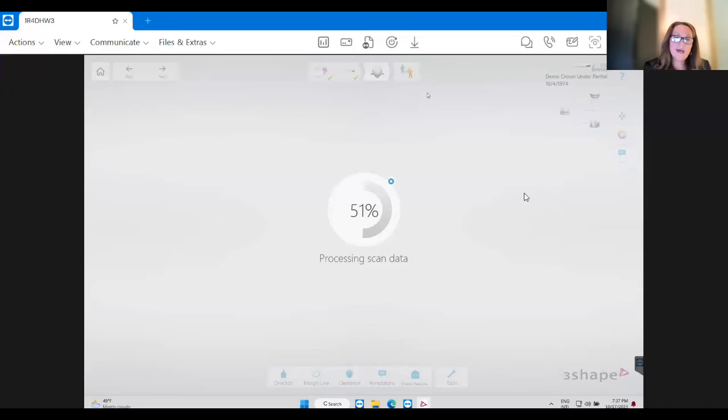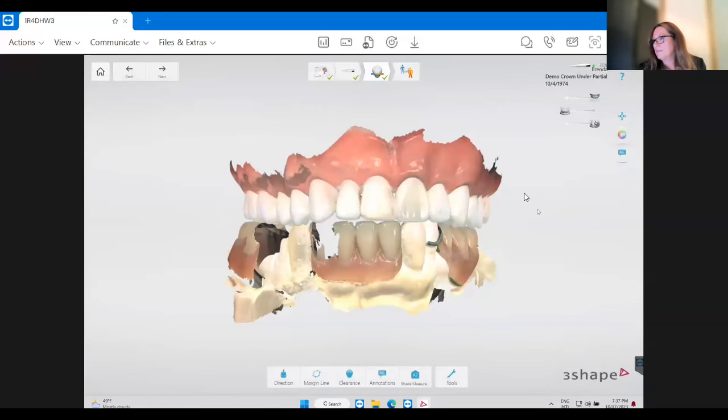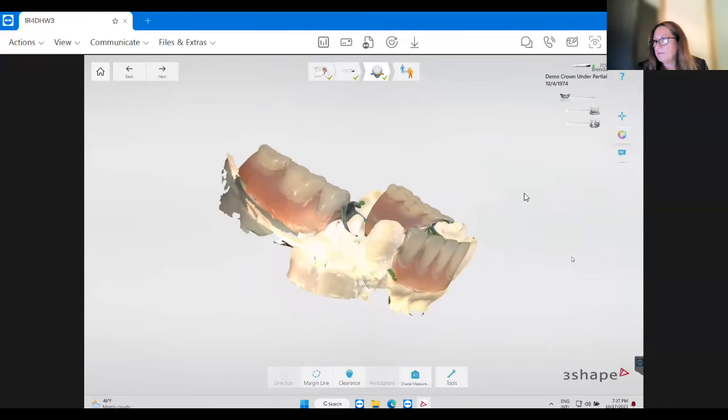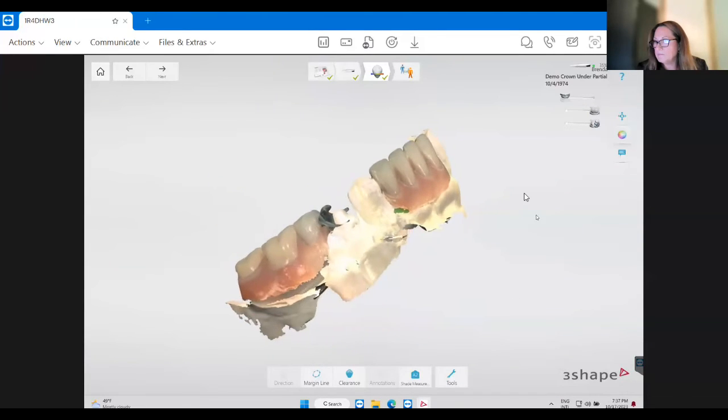If you have more data, it takes longer to process. And I think because I deleted, or like taken time, I'm trying to pull my partial off of there. Anyways, this will show the prep with the partial. See how nice that turned out?